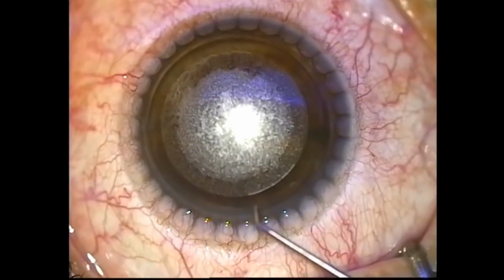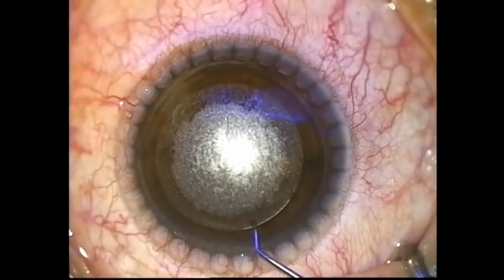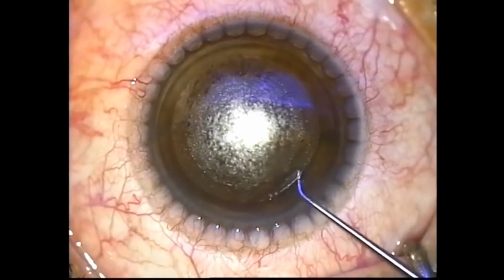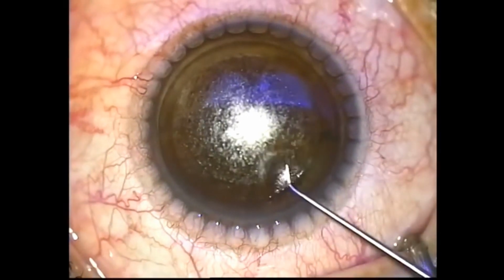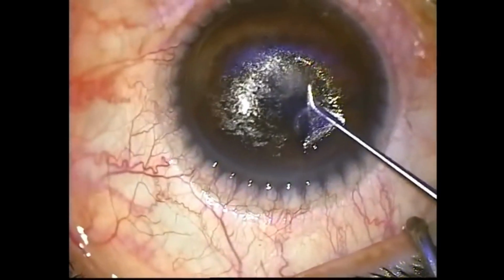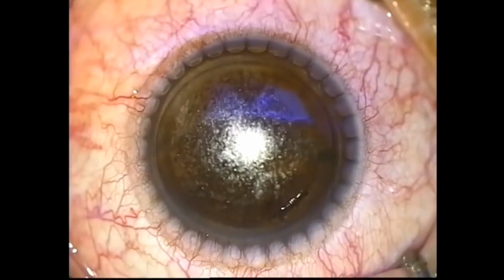So now you've got a separator which separates the initial incision so that you can put your dissector in between. So this is the initial opening you make, and once you've entered that area, then you need to have your dissector ready, which is a spatula. Always want to separate the anterior lenticule first.